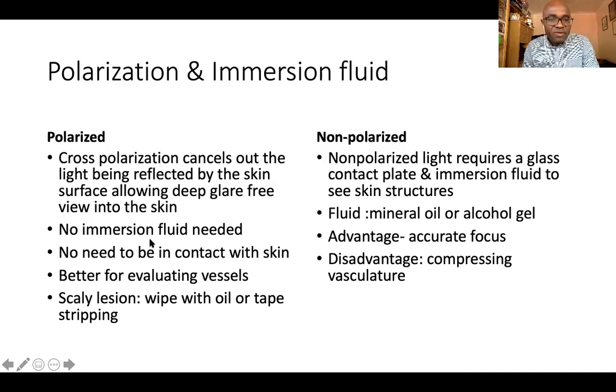As I explained, with polarized light you don't need immersion fluid, and it does not need to have contact with the skin if you're using it as a non-contact form. It's better for evaluating vessels in the non-contact form. And obviously, if you have some scaly lesions on the surface, you might be able to strip them with tape, but when you use oil, you also help remove scales on the skin.